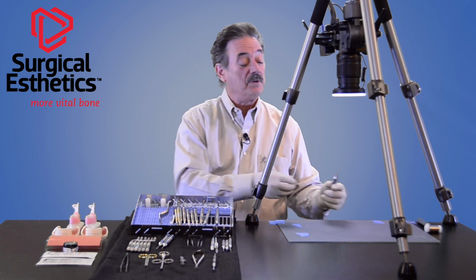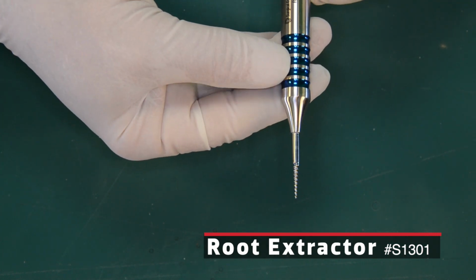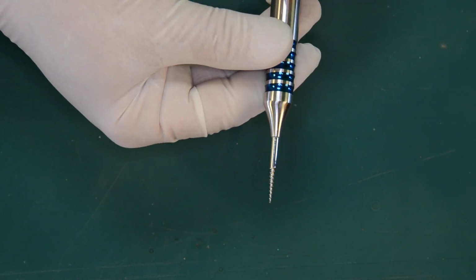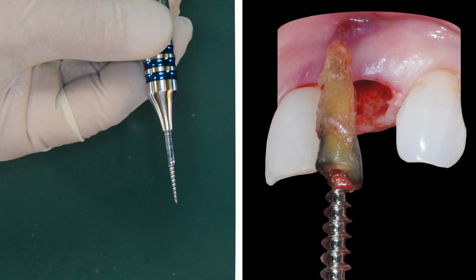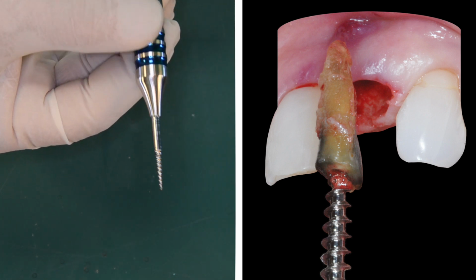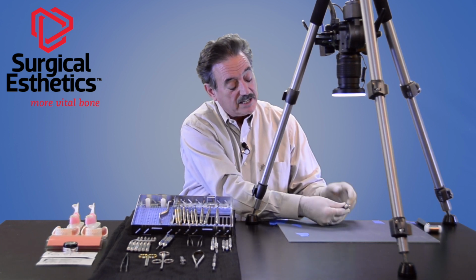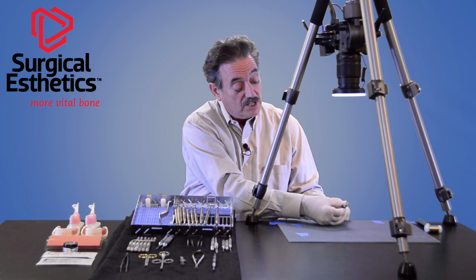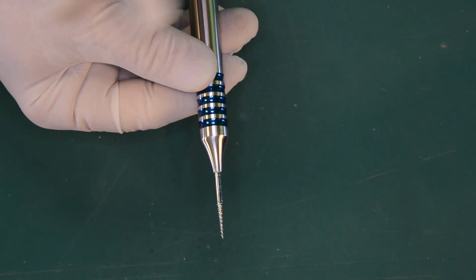The third instrument in that group is our root extractor. It actually looks just like a corkscrew and pretty much works like that. You basically screw it into the nerve canal space. That enables you to position the root so that you can use other instruments to work around it. You don't really use it to screw it in and extract straight out. You use it to stabilize the root and use another instrument around it. The other use for this, which I find very effective, is when we're using the fracture technique on a single root and we're going to cut that root into two pieces. You can use the root extractor to screw all the way down the root, fracture it into two pieces, and then remove the two pieces.